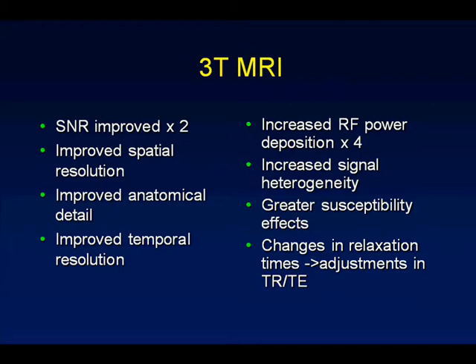Basically, what's called specific absorption rate. MRI is safe. There's no ionizing radiation, but the higher the power, the more strength, they could actually feel the warmth. They may feel warmer on the 3 Tesla scan, but 3 Tesla is still considered clinically safe. When you go into a higher magnet, you're prone to more artifact.